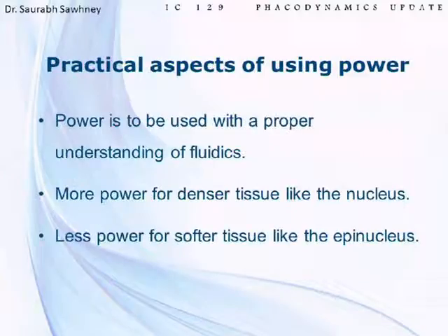So you have to understand how and when and where to use the power. It has to be used with a proper understanding of fluidics. When you're doing phaco, power and fluidics go hand in hand, and as we are progressing in our learning, the importance of fluidics is taking on a greater role. Power is being pushed a little to the background, but you still need to understand how it works. You have to use more power for denser tissues like the nucleus, and when you move to a softer tissue like epinucleus, you have to shift to a lower setting. So you have to understand where to use what.